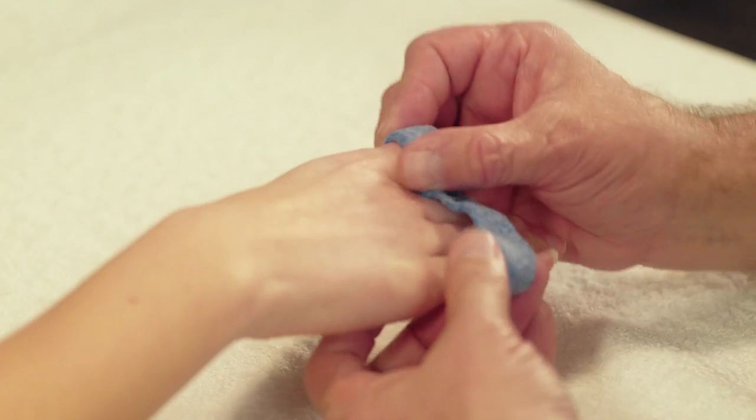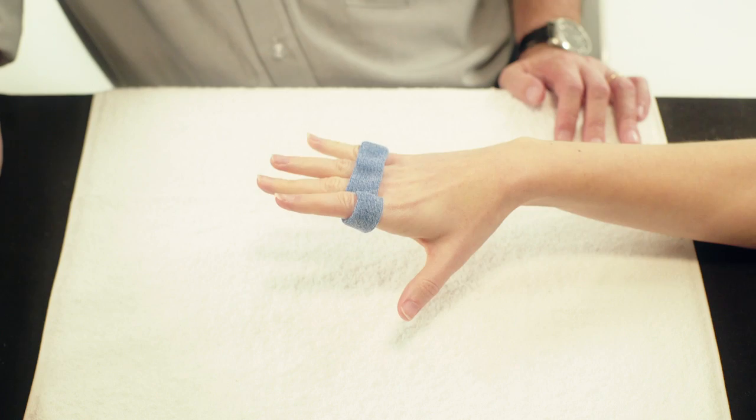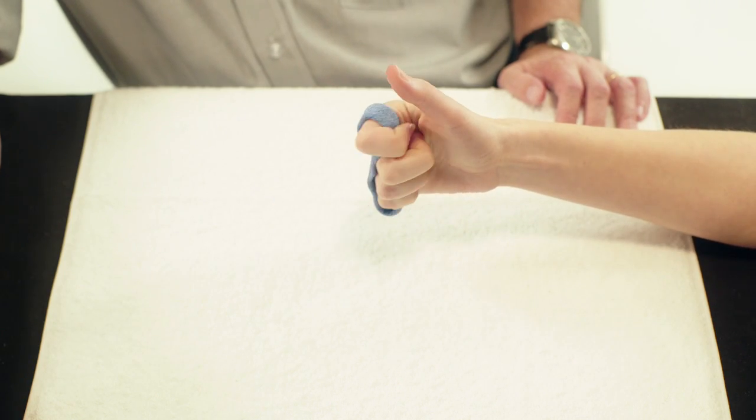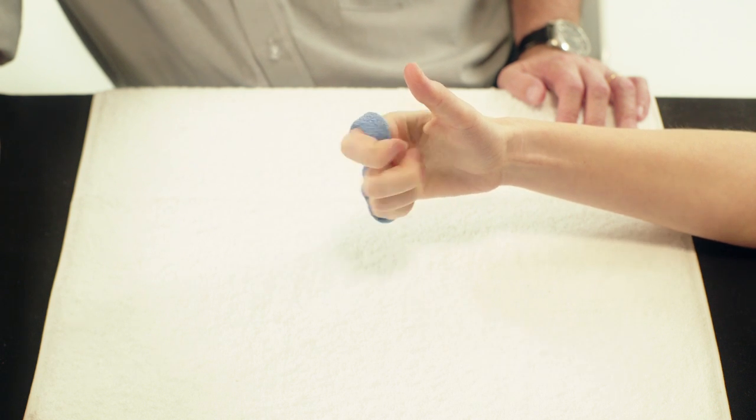This orthosis allows finger flexion, but will protect the extension system of the index finger during flexion of the long fingers.